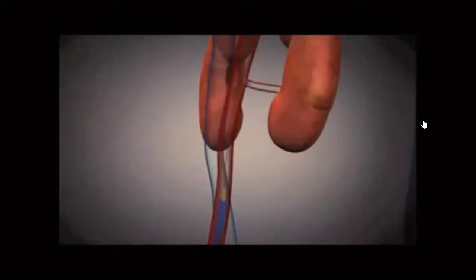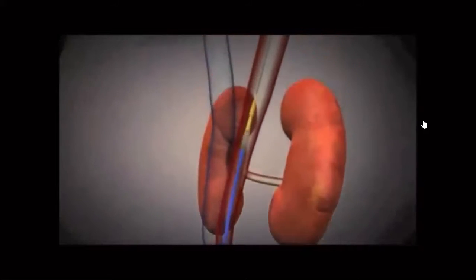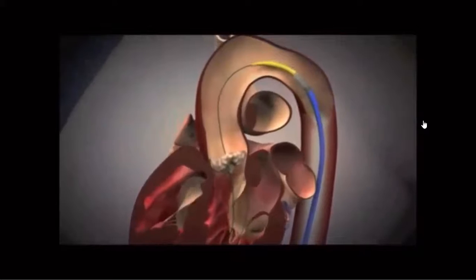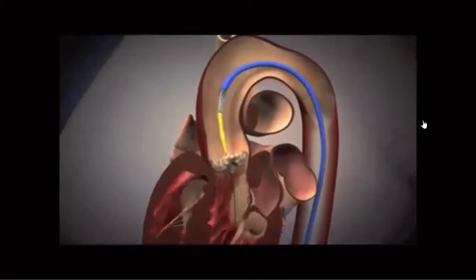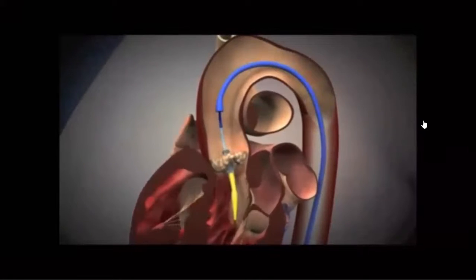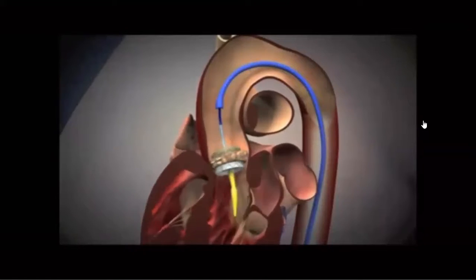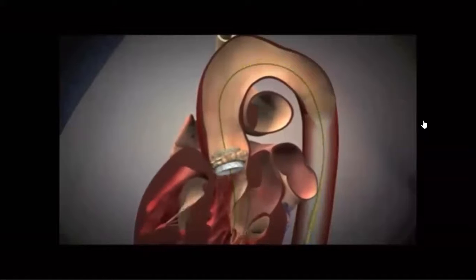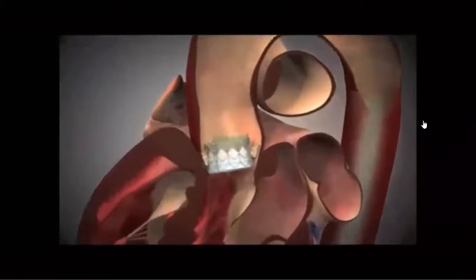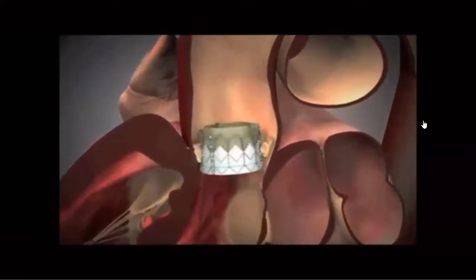The first rendition that you see is the first stage of the catheter going in, and then the second stage of the catheter coming through around the aortic arch over the wire, and it's going to insert into the stenotic valve. Once the catheter is placed in the valve, the stented valve is ballooned open, pushing the diseased leaflets out of the way and leaving a functioning aortic valve in place. And then the wire is removed, and you can see the leaflets of the aortic valve opening and closing, providing normal flow through the valve.